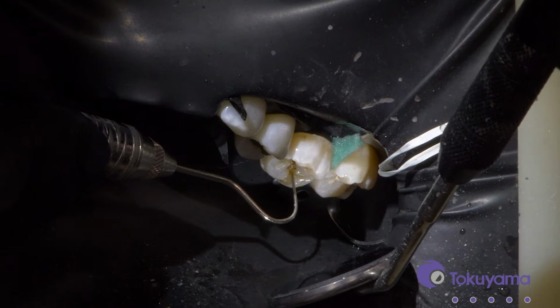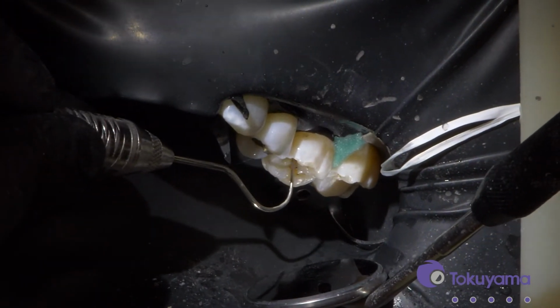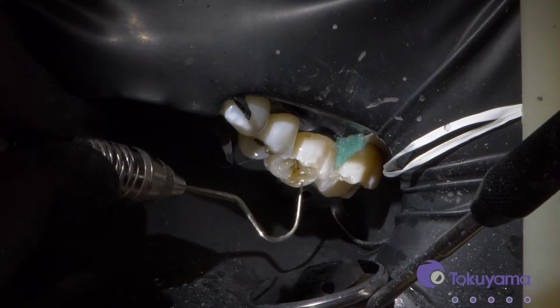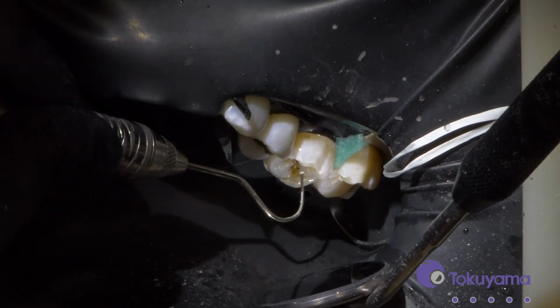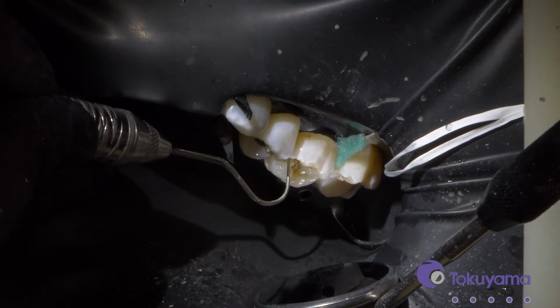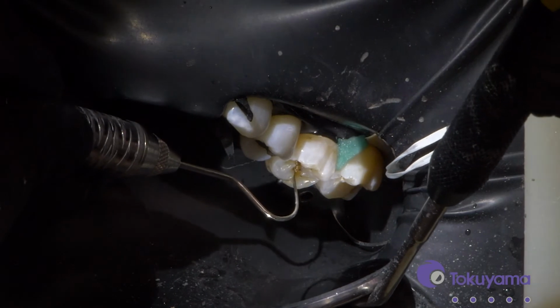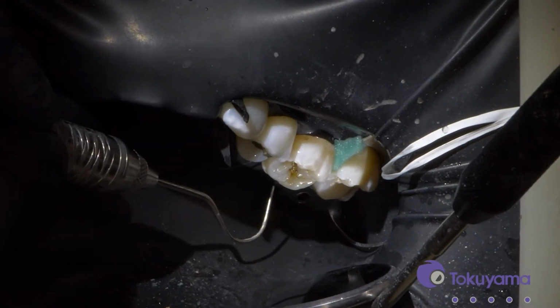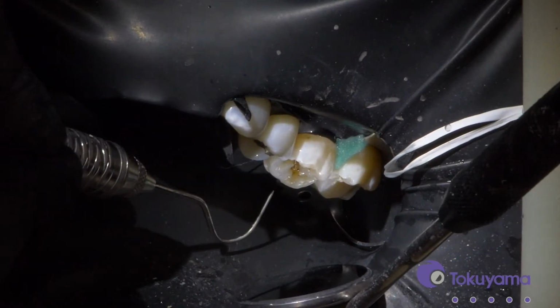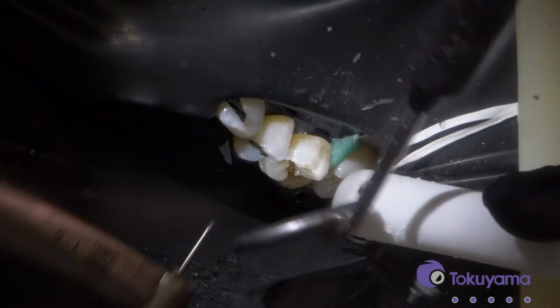So our preparation's nearly done. Margins are clean. You can see here that there's a lot of discoloration underneath this amalgam. I'll probably clean up right here just a little bit more, but the tooth structure is rock solid. So without a doubt, we're going to use OMNICHROMA Blocker Flow to help us block out some of these discolorations. Let's finish smoothing and then we're ready to go.